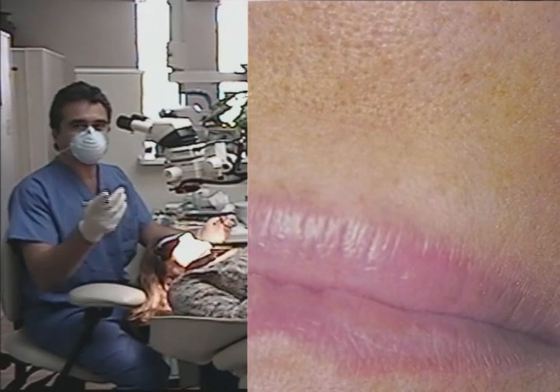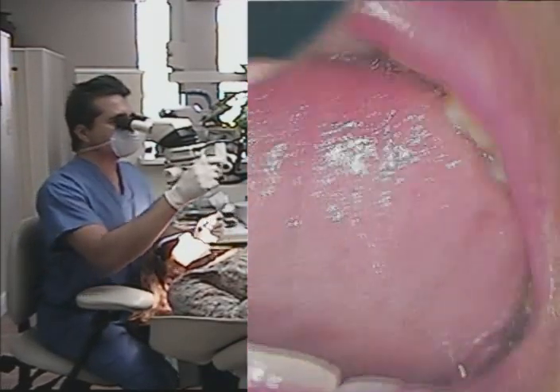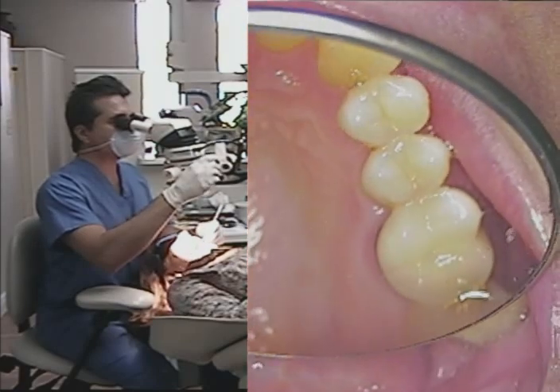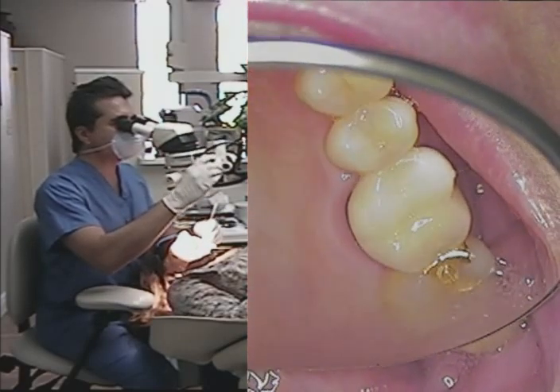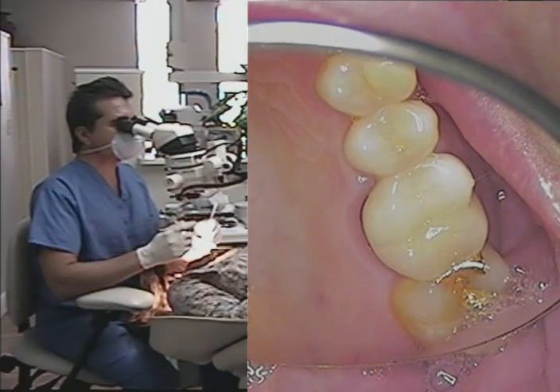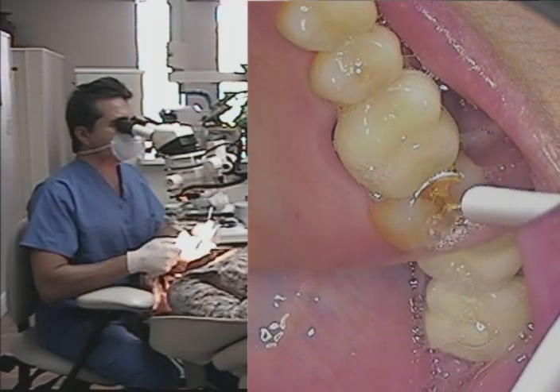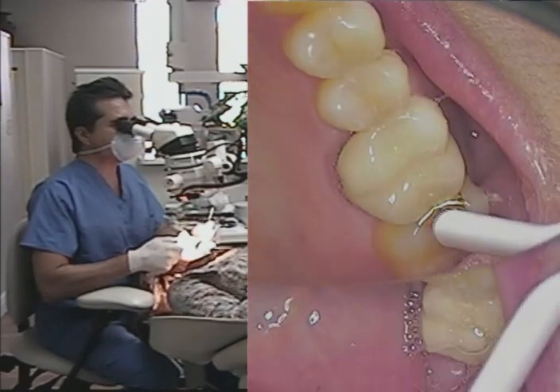So now you're going to be viewing the split screen. We're just going to make a slight adjustment here for fine focus. I'm also going to dry that off so you can actually see this — and now you can see what I'm saying. I'm going to dry off the upper right side.